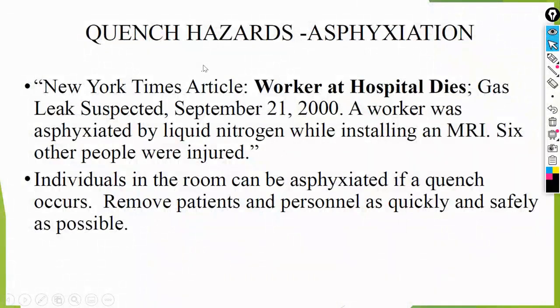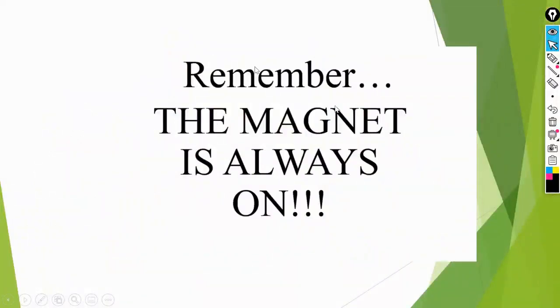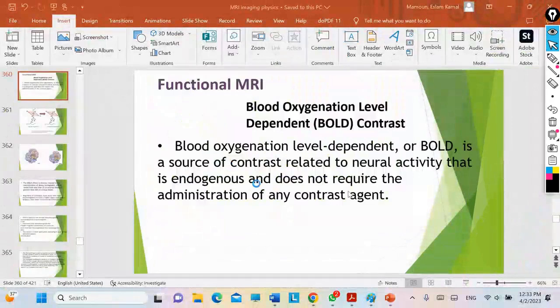It is necessary for the area to be completely clear and for no one to be present. After the quenching process, the gas responsible for the cooling of the magnet must remain. Of course, the magnet is always on. I cannot turn it on and off like with CT or X-ray.